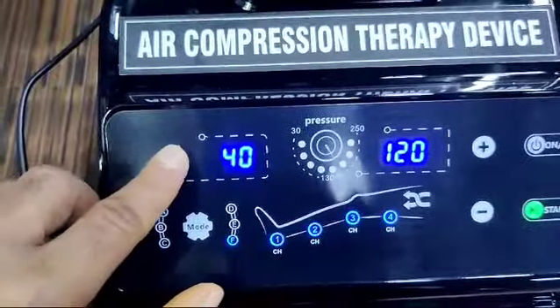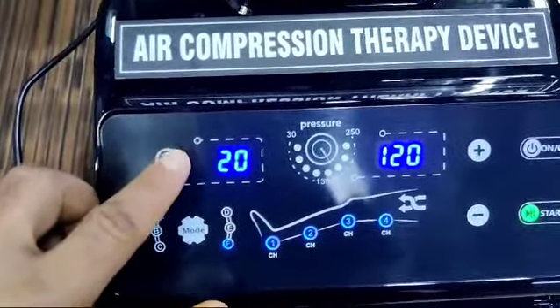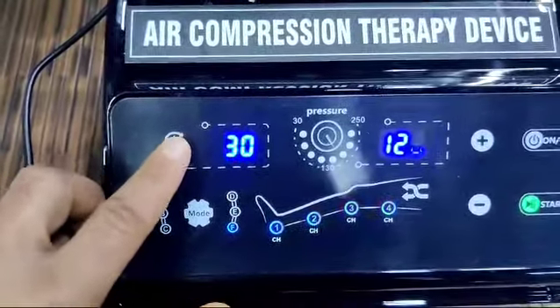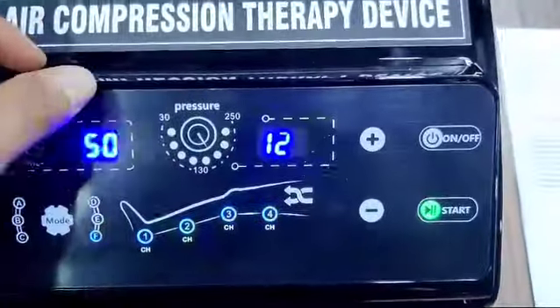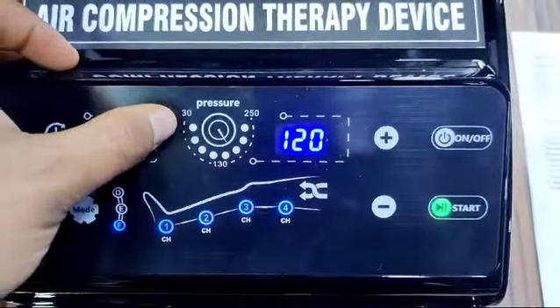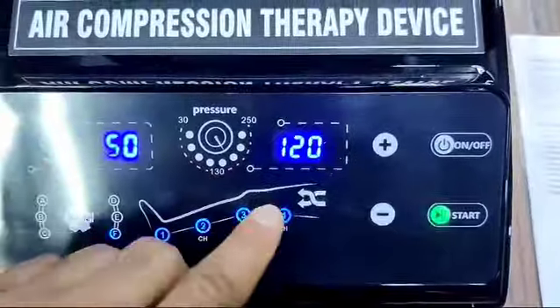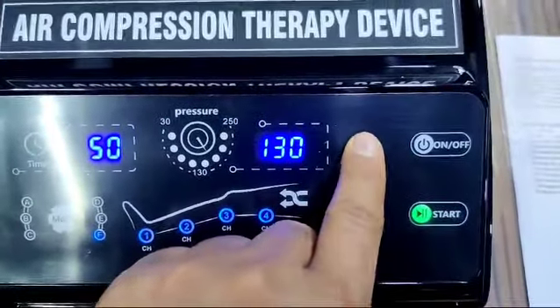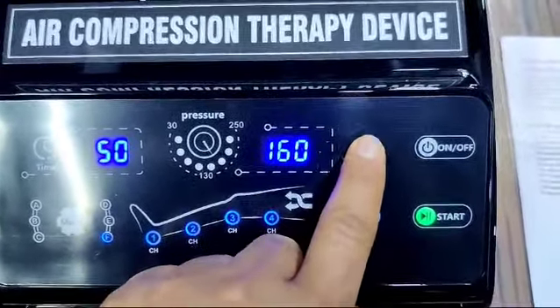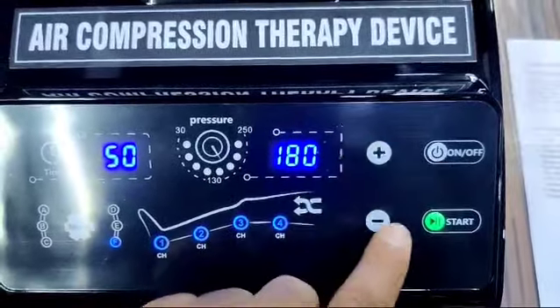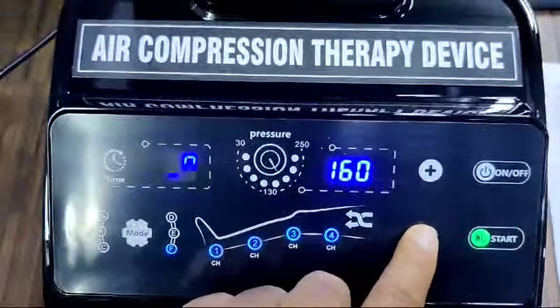This is the timer display. You can increase the timer in multiples of 10: 10, 20, 30, 40, 50, or 60 minutes. The pressure range goes from the lowest to the highest — 30 to 250 — and you can increase or decrease it using the touch buttons.